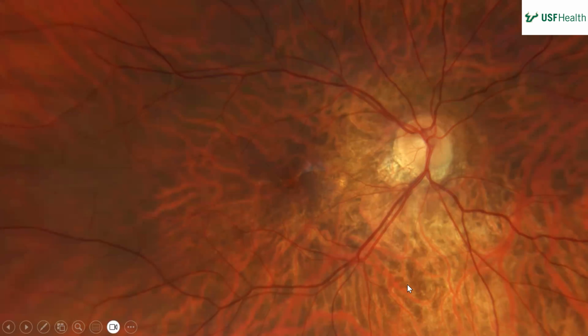She's older. I mean, you look under the nerve, it just looks like she's getting more myopic degeneration. I'm just looking at this stuff down here. That's all kind of like, if you look at that, she's kind of just thinning out like myopes do. Yeah, like this is probably bigger than it was before.